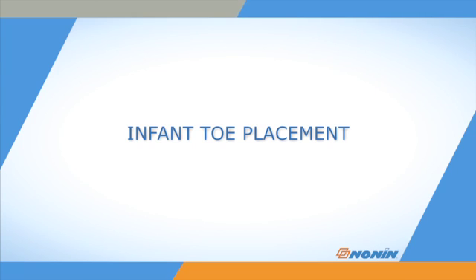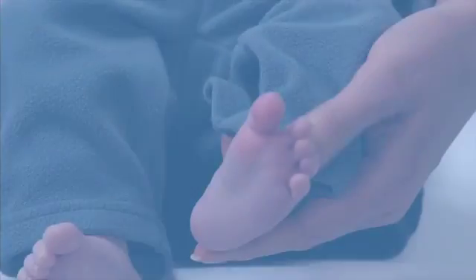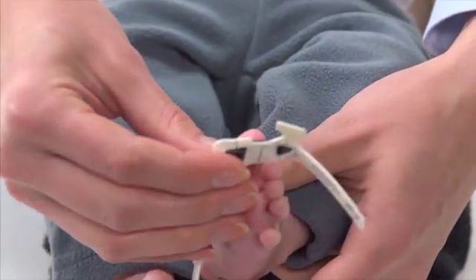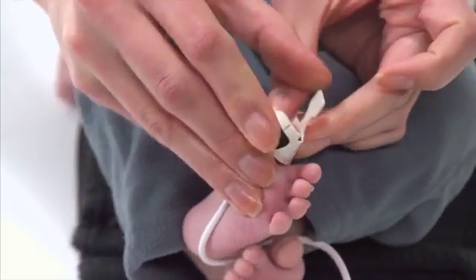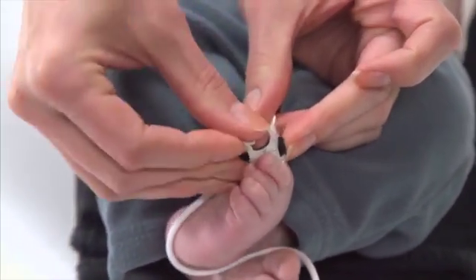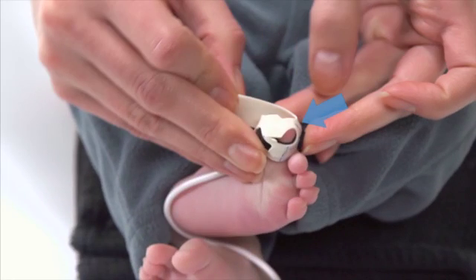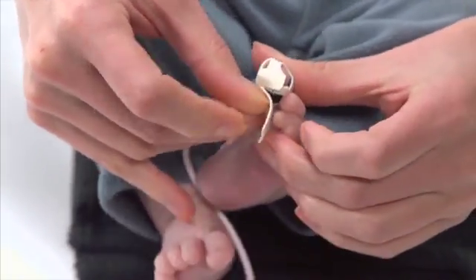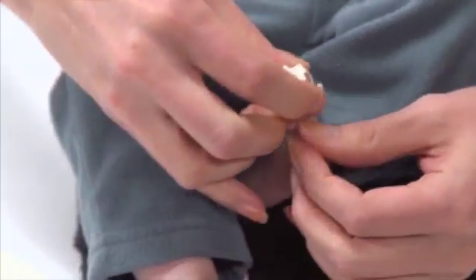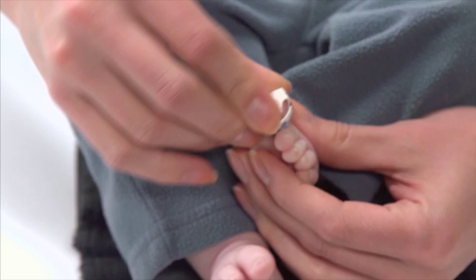For placement on the large toe of an infant over 4 pounds in weight, place the adhesive and detector portion on the bottom center of the toe, with the cable running back toward the heel. Now wrap the sensor on top of the toe, placing the emitter on the top of the toe across from the detector on the bottom of the toe. Gently wrap the tab over the tip of the toe to overlap and secure the sensor to the toe.